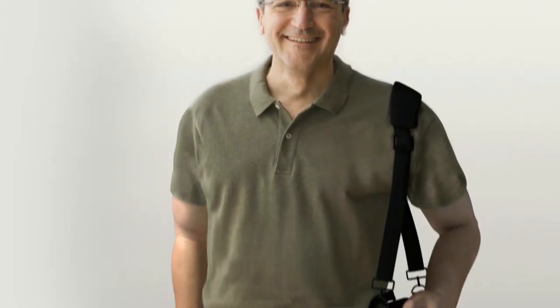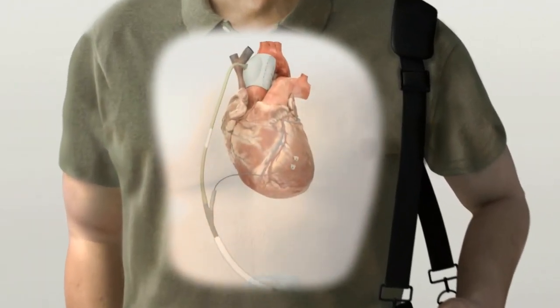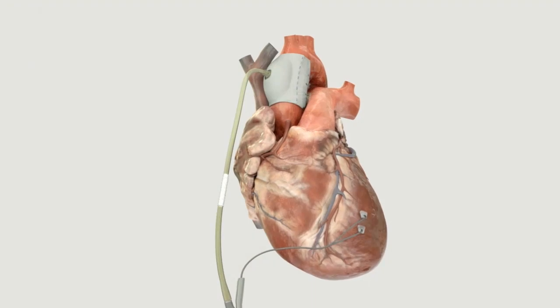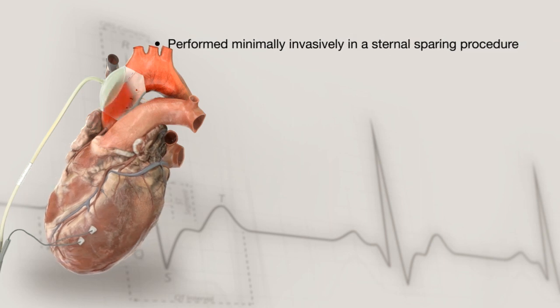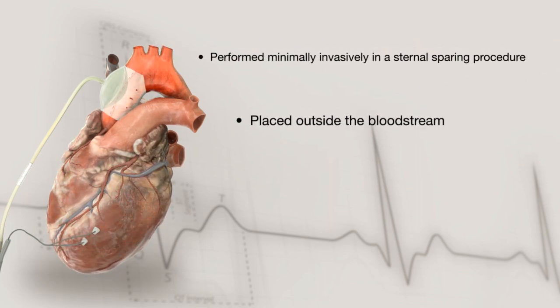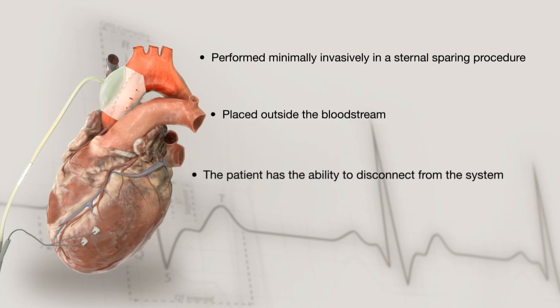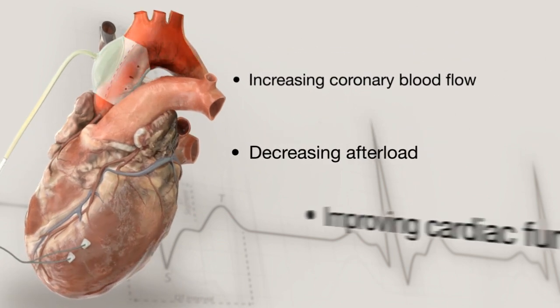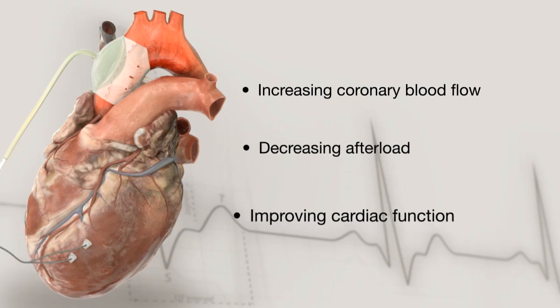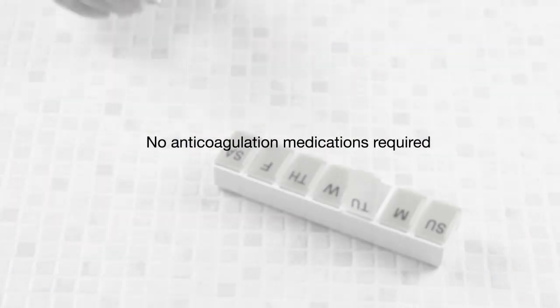The C-Pulse Heart Assist System is an extra-aortic balloon pump using well-understood counterpulsation technology to treat moderate to severe heart failure. Its primary benefits are that it may be implanted minimally invasively in a sternal-sparing procedure without the need for surgical bypass. It is placed outside the bloodstream, the patient has the ability to disconnect from the system for brief periods of time, and it does not require the patient to be on anticoagulation medications. It is designed to improve heart function by increasing coronary blood flow, decreasing afterload, and improving cardiac function.